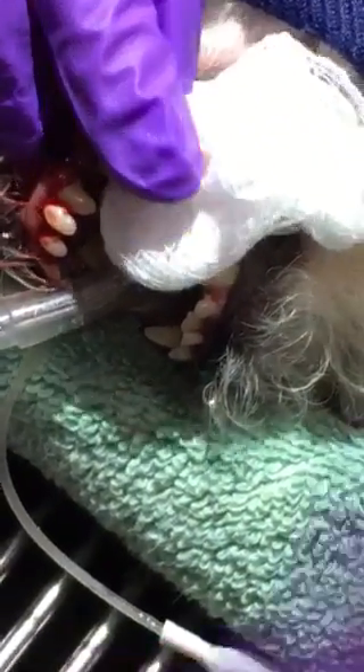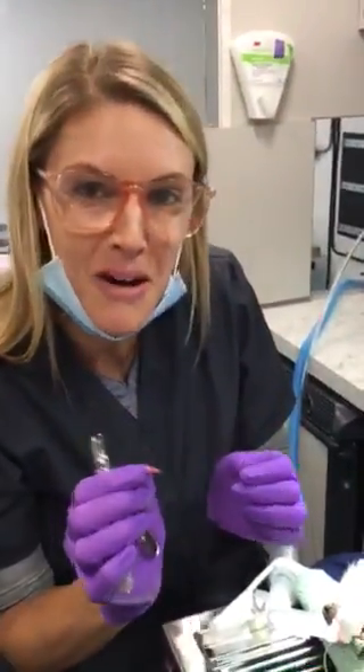Then we're going to take another instrument. It takes a lot of patience to do these, and we just very gently pull it out. You can see when we pull out the tooth it wasn't really attached to very much to begin with. So there's Mim's little tooth — it's very cute, we'll save it for her mom.